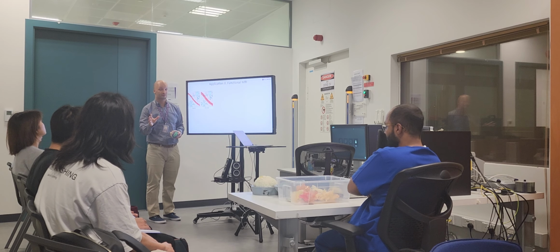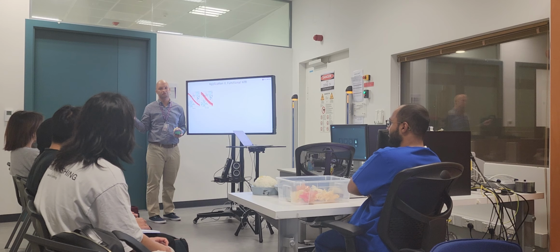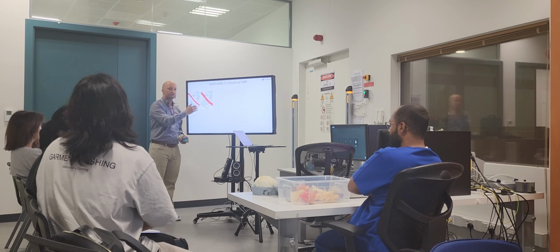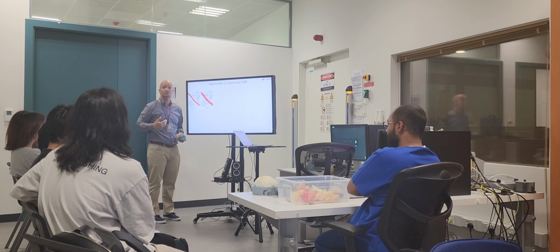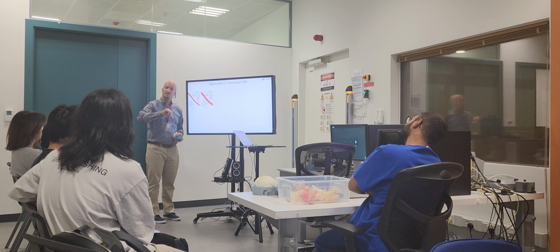Again, we need a reference. If I cannot do this, then I will have no reference. What I need is a rest and then move. A rest and move. Then I'm going from here to there, here to there. Usually, if there is activation, there is oxygenated blood gushing in. Oxygenated blood is diamagnetic. Deoxygenated blood is paramagnetic.